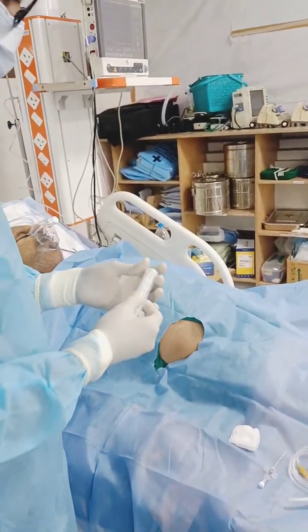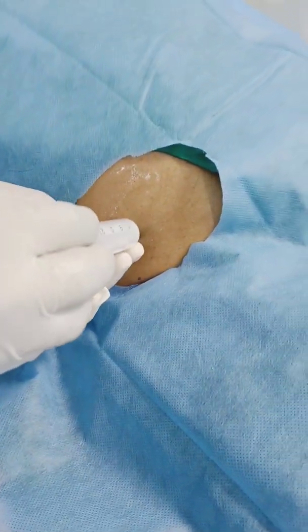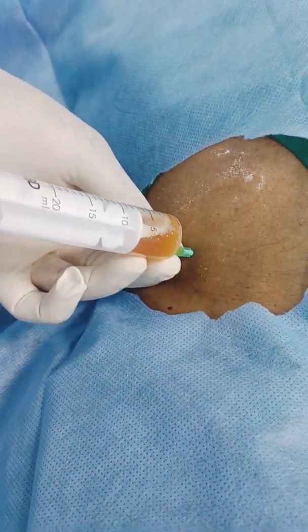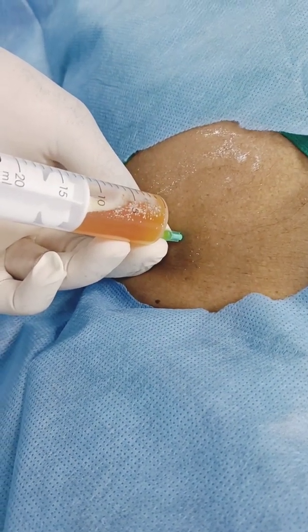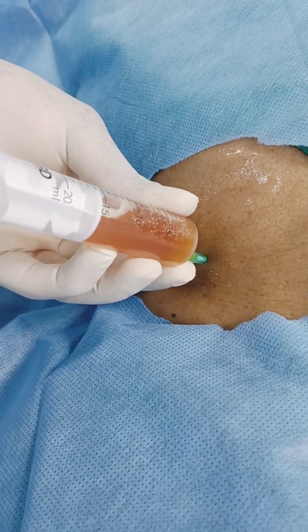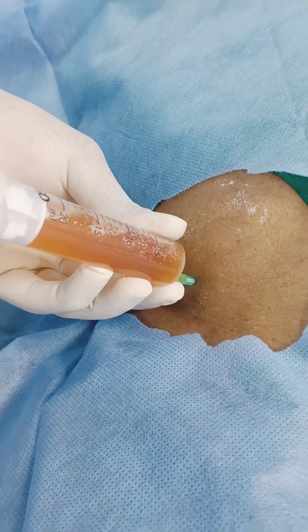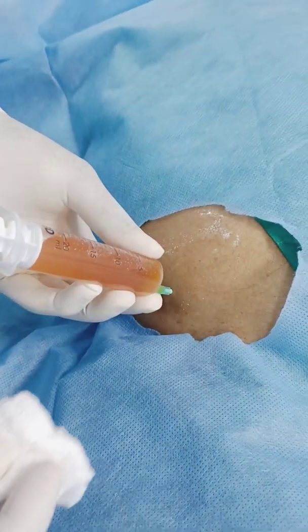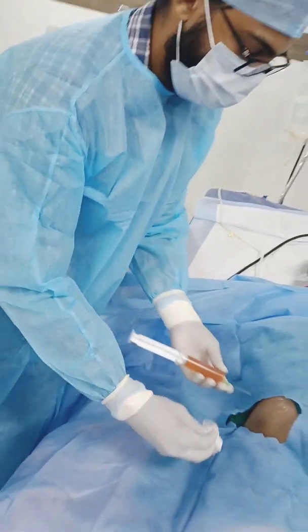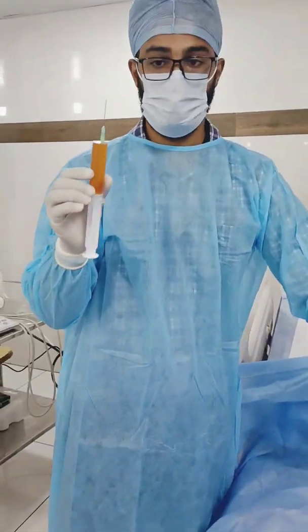Take a 20 ml syringe and insert it into the abdominal cavity through the skin, and aspirate until you see the ascitic fluid. Collect 20 ml for diagnostic purposes. That's the ascitic fluid for diagnostic purposes.